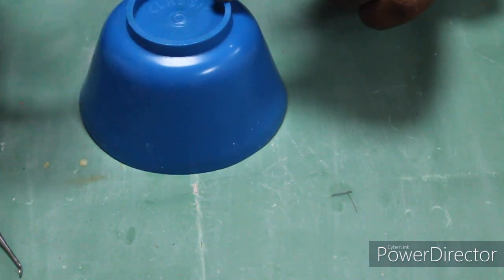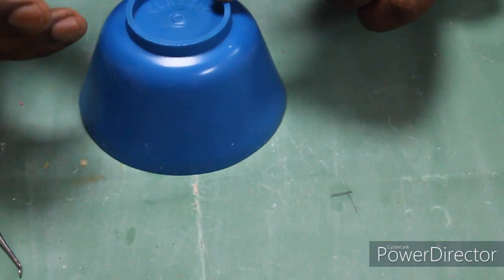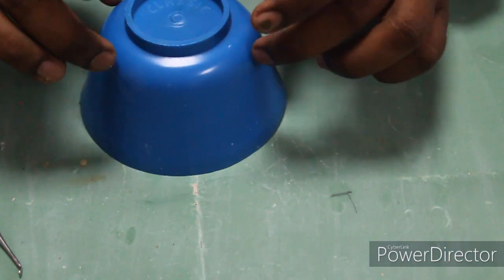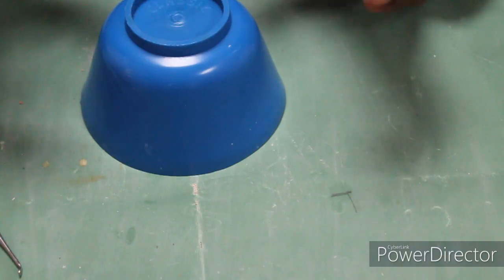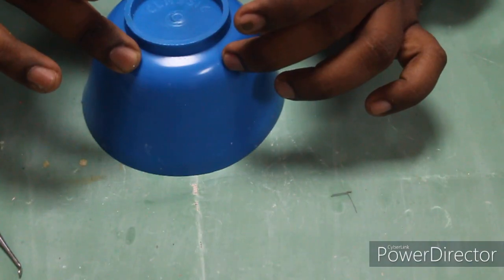So if it is getting evaporated, then the polymer will be lacking monomer to wet, so it will cause porosity. So in order to prevent that, we cover with this rubber bowl or any container, by which we are giving a saturated atmosphere of the monomer, so it will not cause any voids in the surface of the special tray.